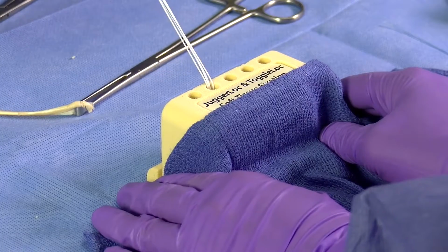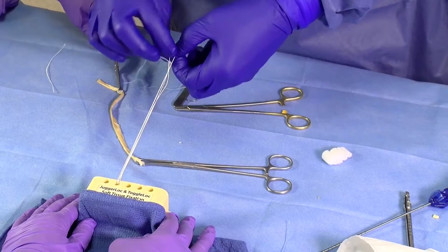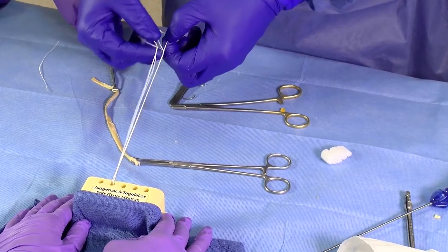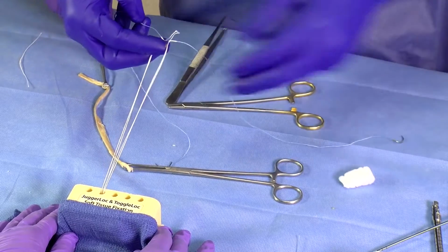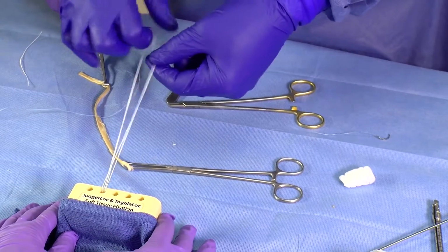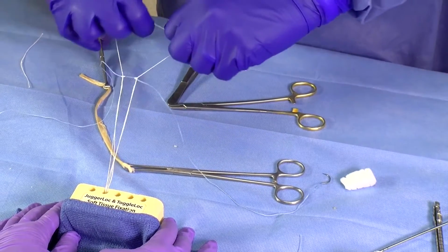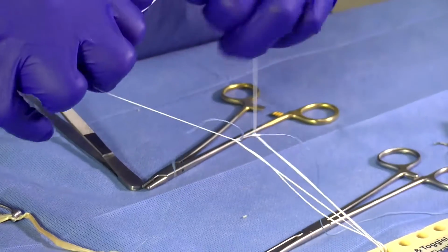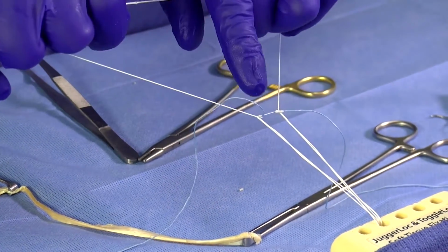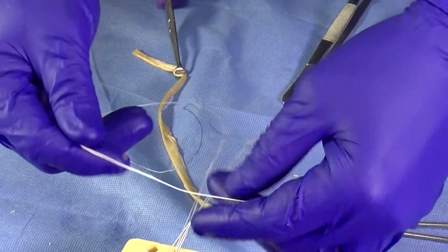Once you have the implant deployed, because a lot of this comes off and people aren't sure, if they're unfamiliar with the implant, what to do with it. So I am going to unwrap the implant, spread, this is once again a 2/9 ToggleLoc with needles, and I will actually shorten this to some extent. This is once again our attachment point, this blue stitch here in the middle.